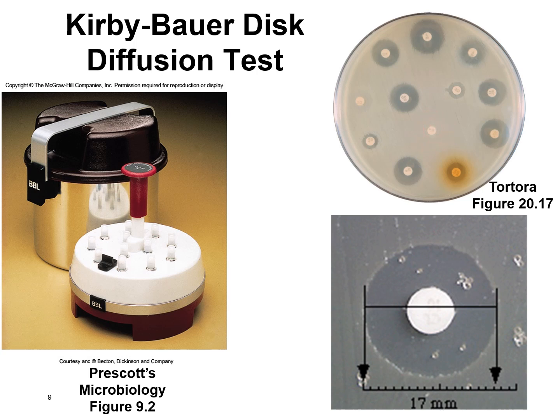So what we can do with this information is we will actually measure this zone of inhibition here. They just measure that in millimeters. So maybe we measure this one up here, and let's say that measures to be 22 millimeters.